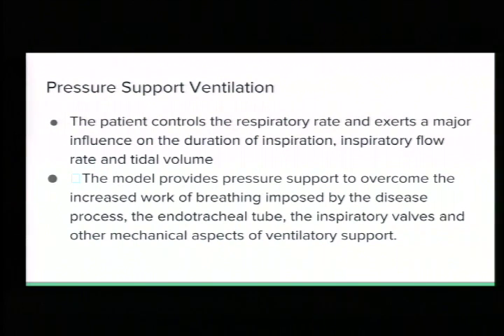With pressure support, the patient controls the respiratory rate, and they have the major influence on the duration of inspiration. So how long they're inhaling, how long they're exhaling, and tidal volume. So this provides support to overcome increased work of breathing that is caused by having the endotracheal tube in place, all that dead airspace that we talked about, all the inspiratory valves and the mechanical aspects of the vent.